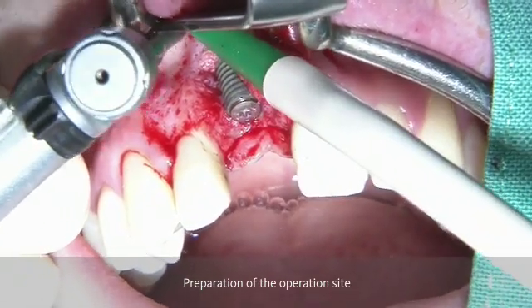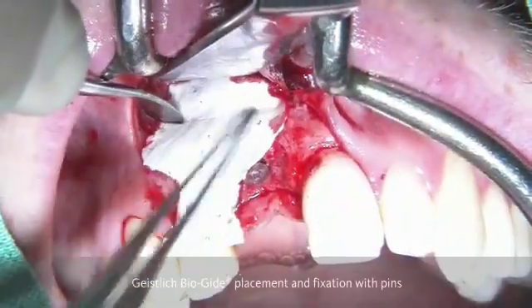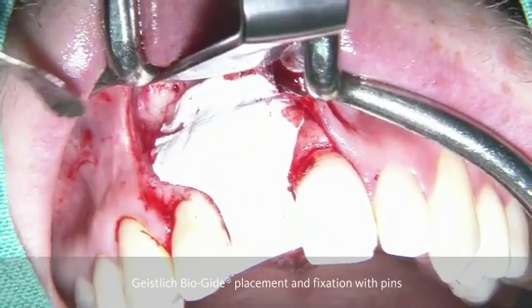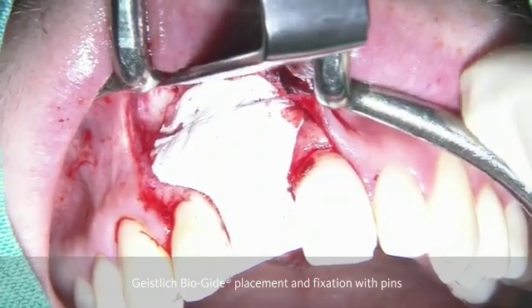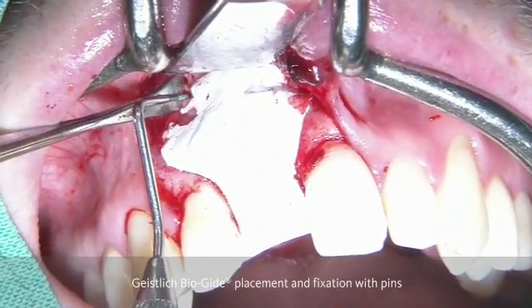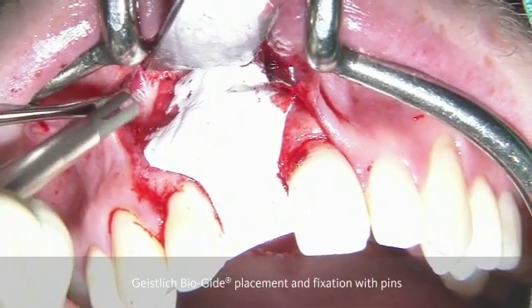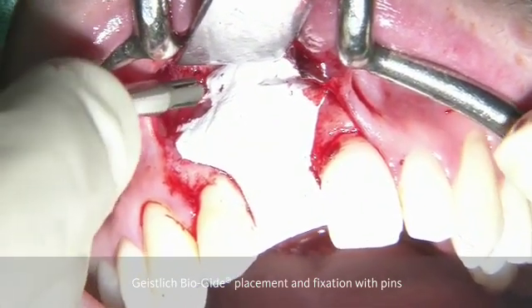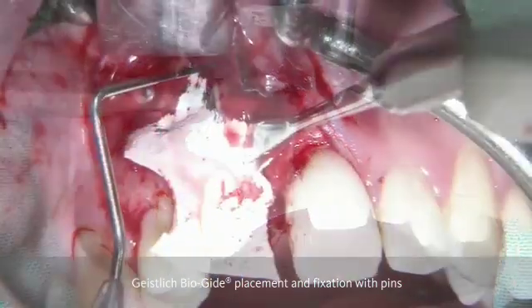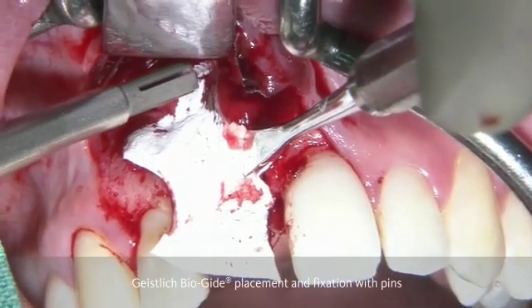As a first step, we are preparing the site by drilling holes in the apical part — more than two — which are the ones that take up the pins to stabilize the GBR membrane, which is going to be shaped according to the defect dimensions. Now we can see here the resorbable pins made of polylactide, which are going to be placed in the holes in the apical part.